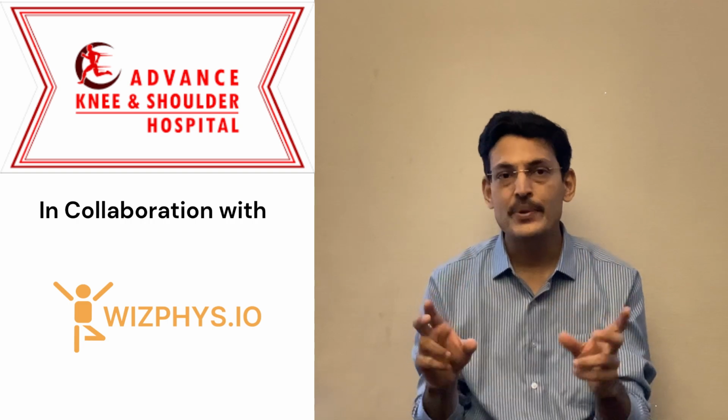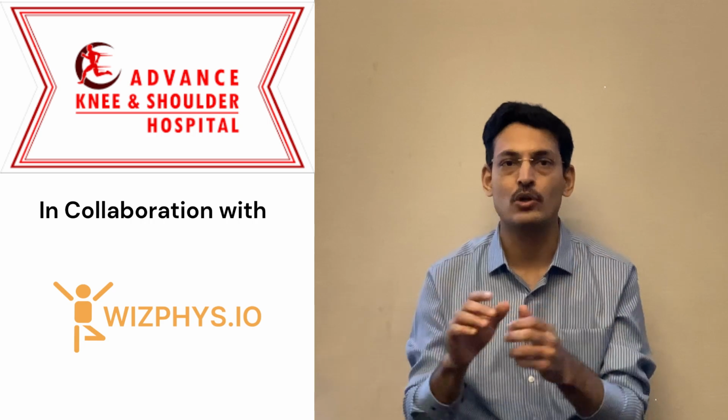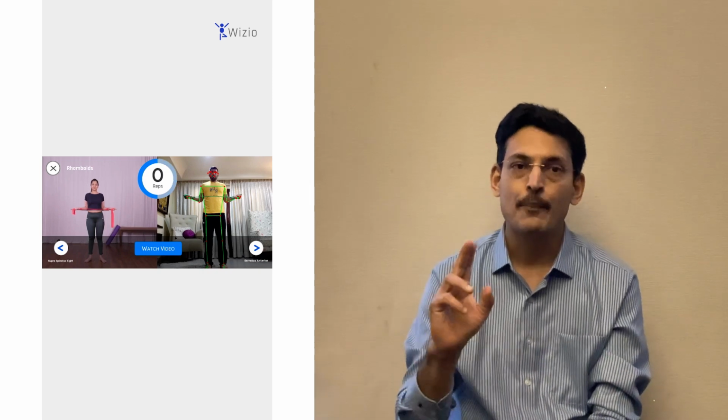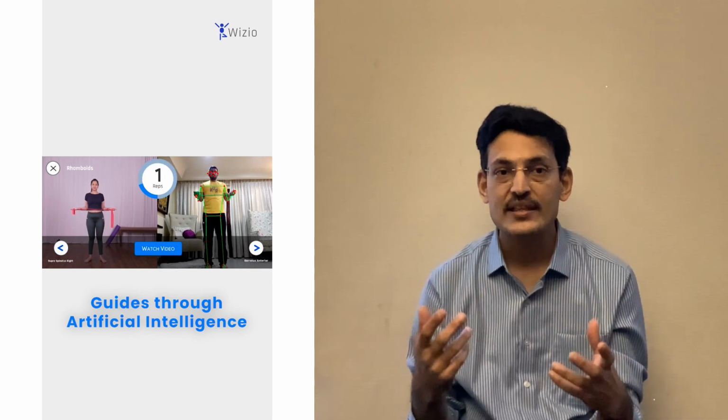The other very amazing thing this app gives us is motion tracking technology. The patient can put their phone in front of them and do the exercise in front of the camera, and the camera will assess whether the patient is doing the physiotherapy appropriately or not. It will also send feedback to us as surgeons on whether the exercise has been done as per the proper protocols or not.